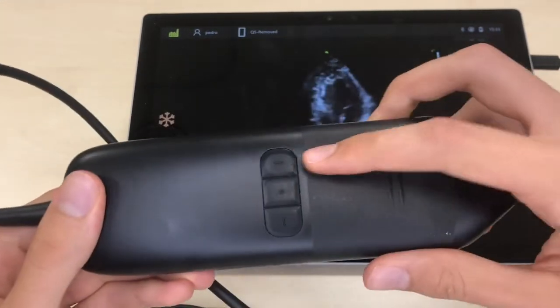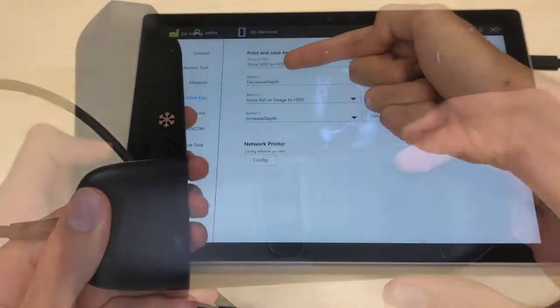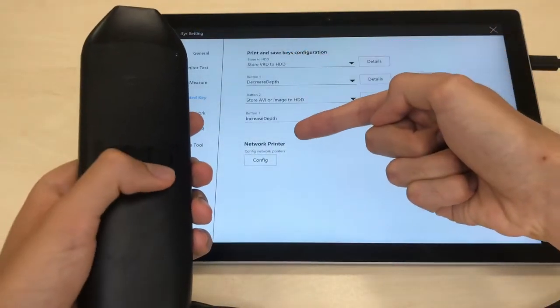It has three configurable physical buttons. In my case I set them to increase or decrease depth and to record a five-second clip.